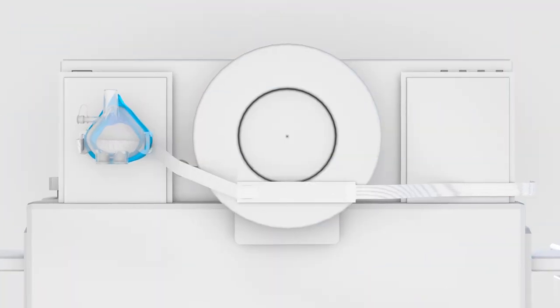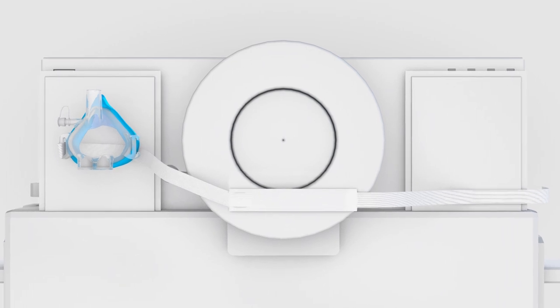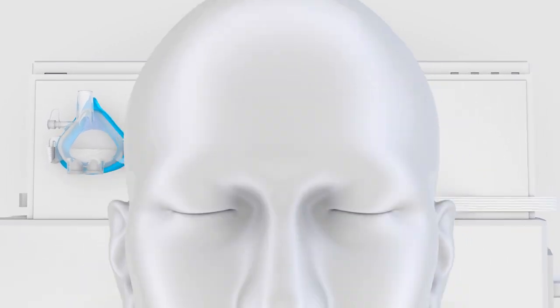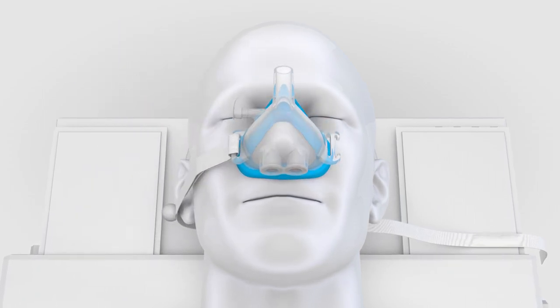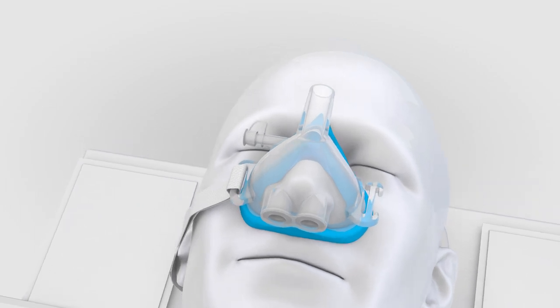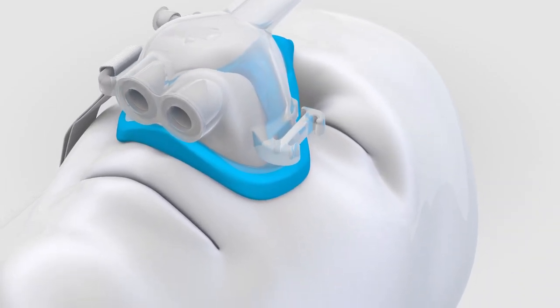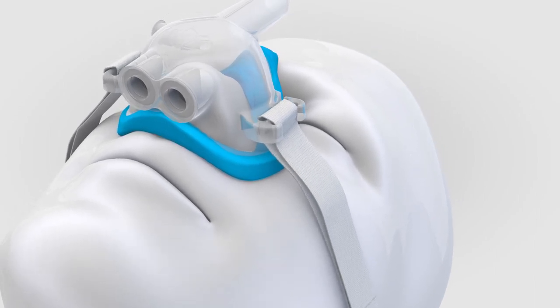Lay the head strap on the procedure table where the head will be placed, with the SuperNova device to the patient's right. With the head resting over the strap, place the mask over the patient's nose with circuit connection pointing cephalad. After wrapping the SuperNova device head strap around the head, loop it into the cleat and secure it to itself using the hook and loop contact points.